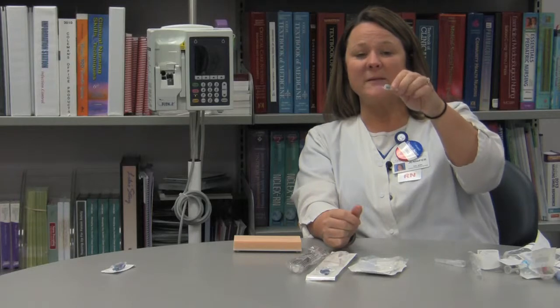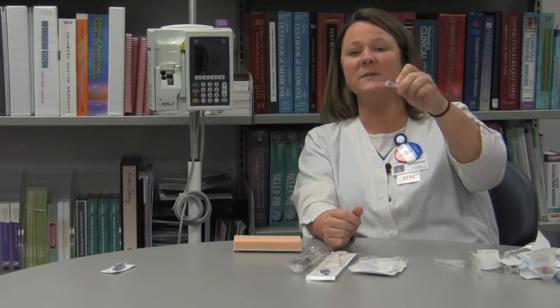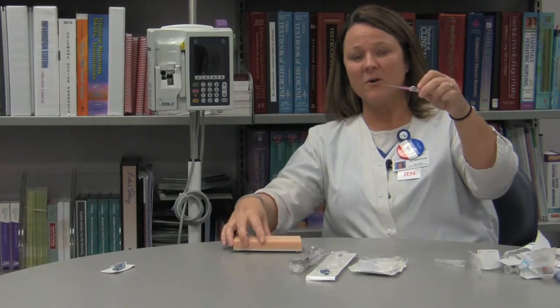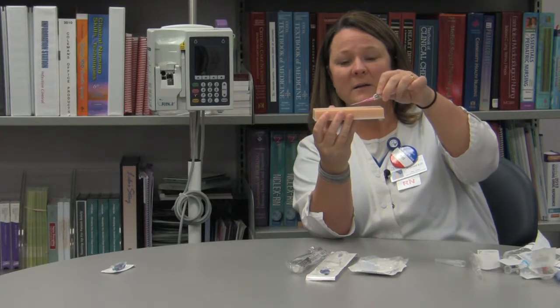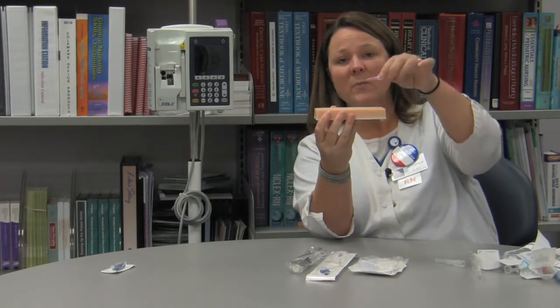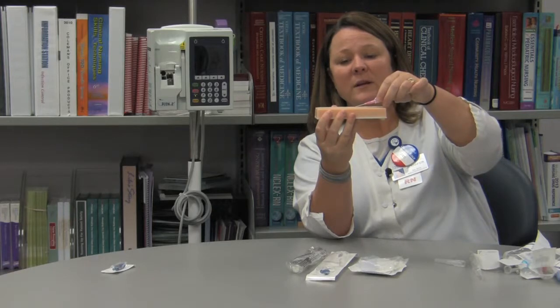The nice thing about this catheter is that as long as your white button's up, your bevel's up, so you don't have to look and make sure your bevel's up. Just make sure your white button's up. When you get ready to start your IV, the company recommends that you go at a 30-degree angle. If you were taught a higher angle in school, when you're using this angiocath you need to go about 30 degrees when inserting into the vein.